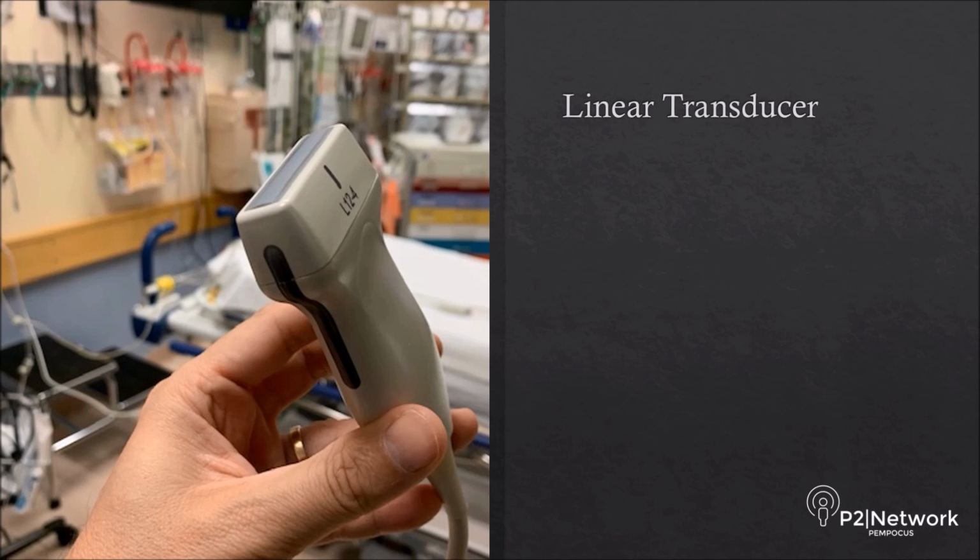I use the linear transducer when I'm looking for these fractures because there's not much adipose tissue between the skin and the sternum typically. You also want a high quality image, and the higher frequency probe allows you to do this.